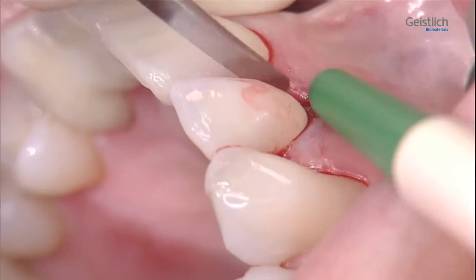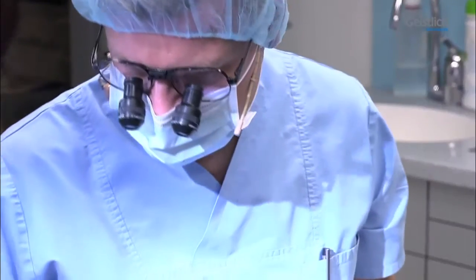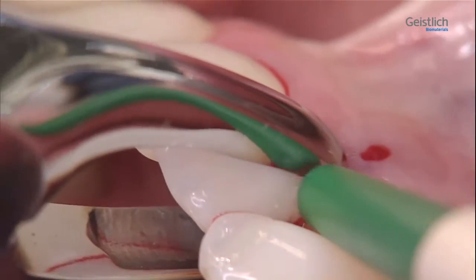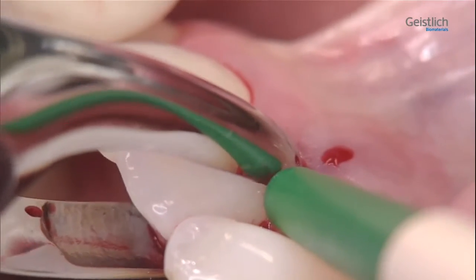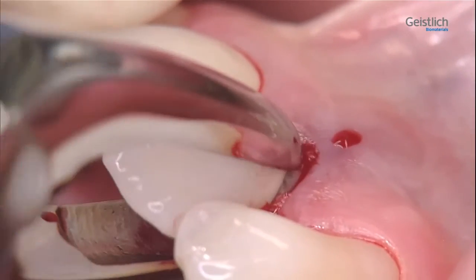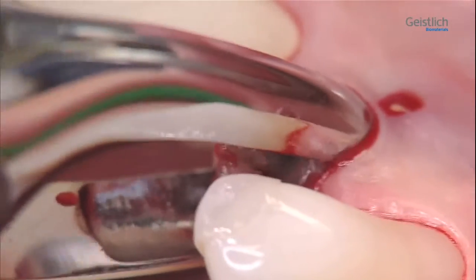We now mobilize the tooth with a small lever instrument and extraction tools according to Karl Ludwig Ackermann, and remove it with an extraction forceps using careful rotational movements. Occasionally, as in this case, the prosthetic crown can be lost during this process. But the final removal of the tooth will pose no problem.